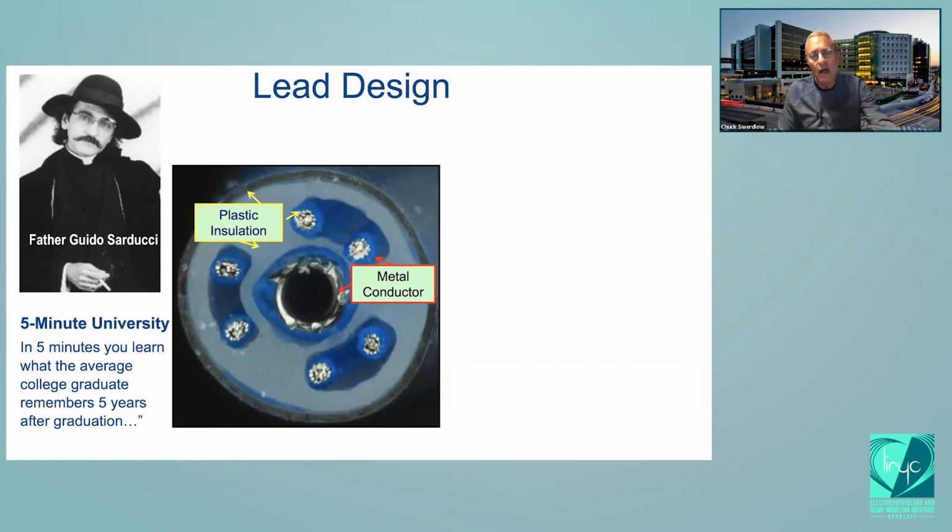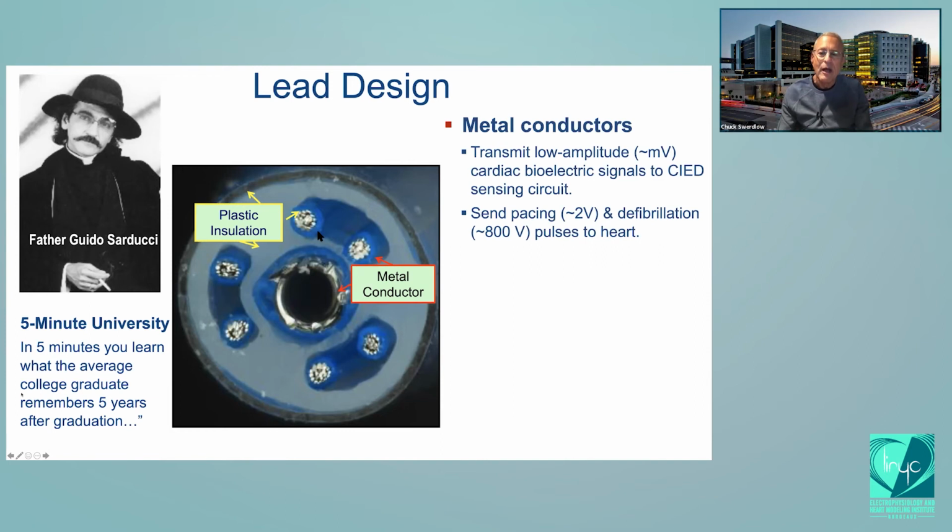So the 5-minute course on lead design is, leads consist of metal conductors that run through them and plastic insulators that surround them. But of course, I have almost a half hour left.